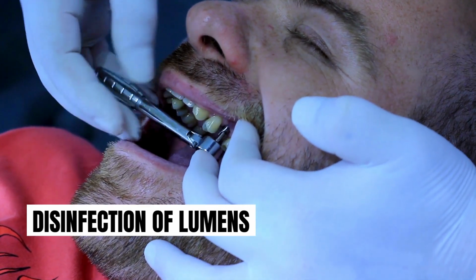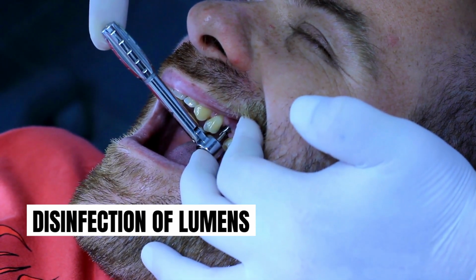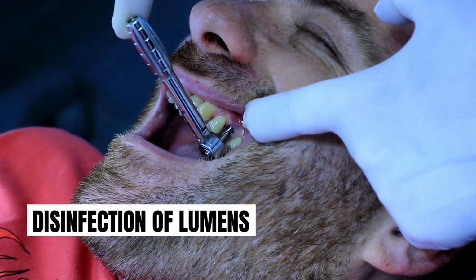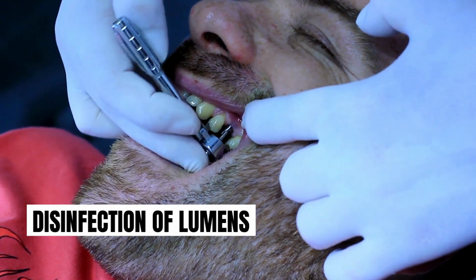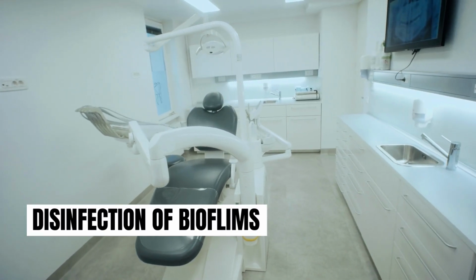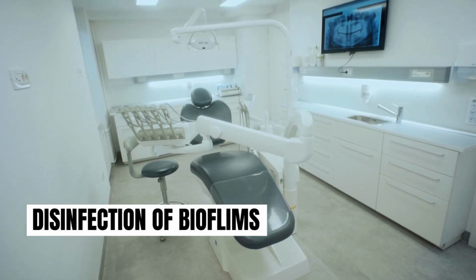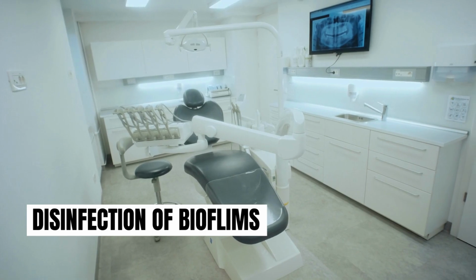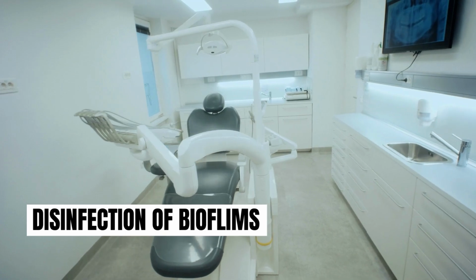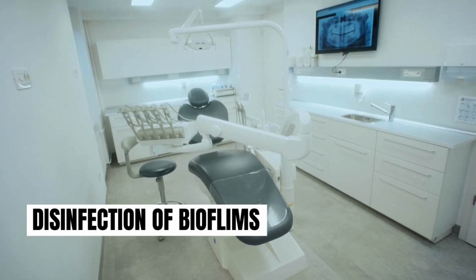So, the lumens and fissures of all dental handpieces must be adequately disinfected with glutaraldehyde solution before any fresh patient is taken. Glutaraldehyde is useful in disinfection of the biofilms which are present in the dental unit waterlines. To avoid bacterial contamination in dental unit waterlines, protective valves can be installed to prevent the backflow of water from the handpiece into the waterlines.